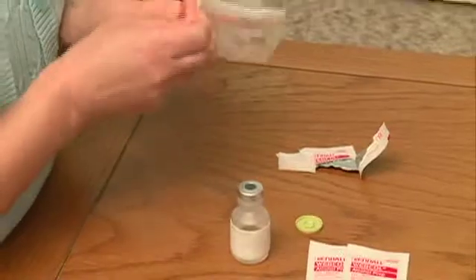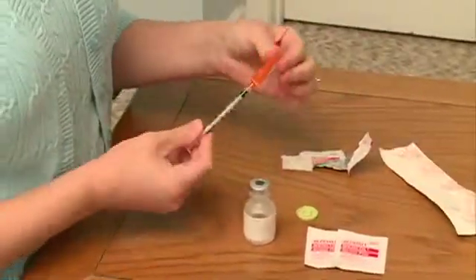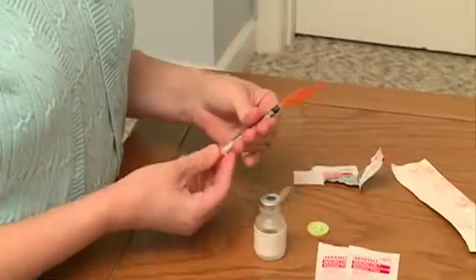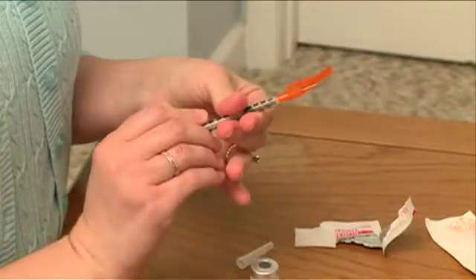Remove the syringe with the attached needle from the package. Remove the safety cap from the needle. Draw air into the syringe by pulling back on the syringe plunger. The air drawn into the syringe should be the same as the amount of medicine you will pull out of the vial.